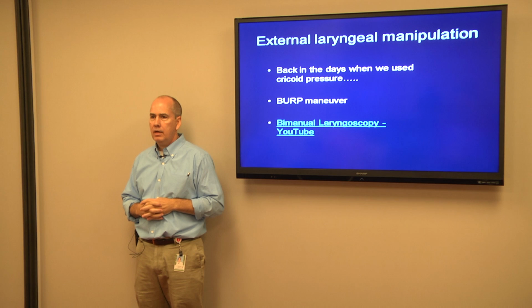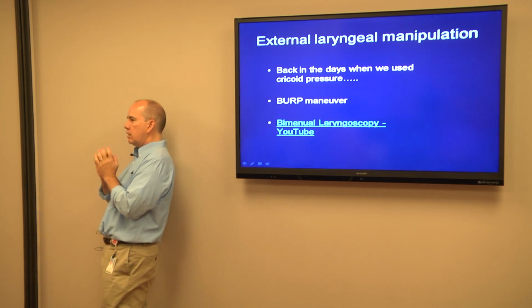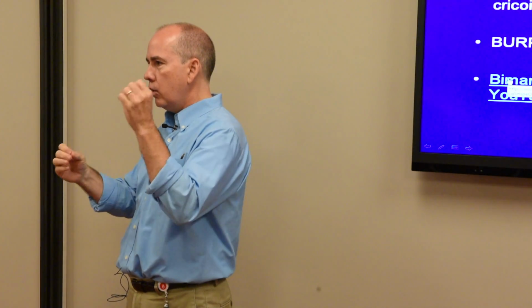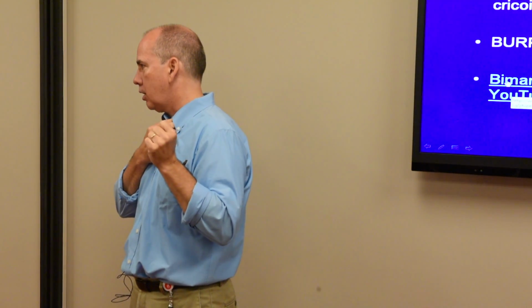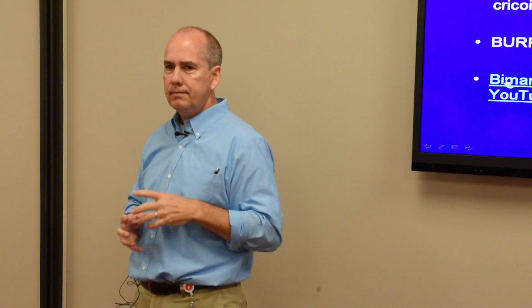Next, all right? External laryngeal manipulation. And if I can do anything particularly with our trainees, if you can leave our program automatically with your right hand, while you have that laryngoscope in your left hand, your right hand is on that patient's neck, putting that to work, then I would have done my job, because it can help us so much, right?